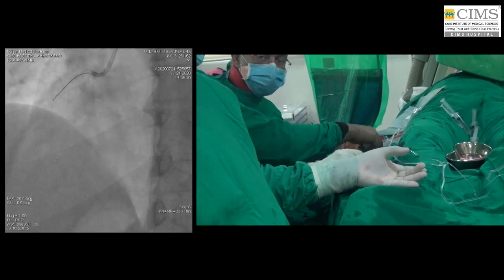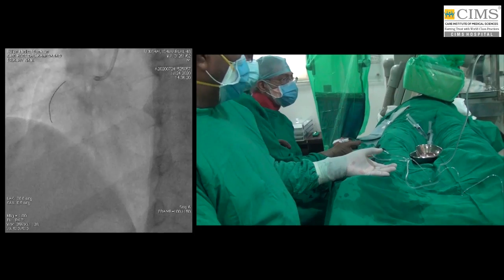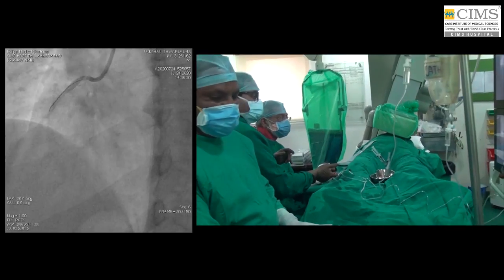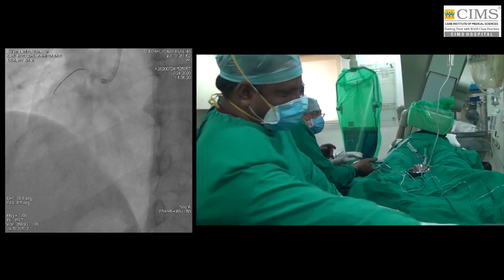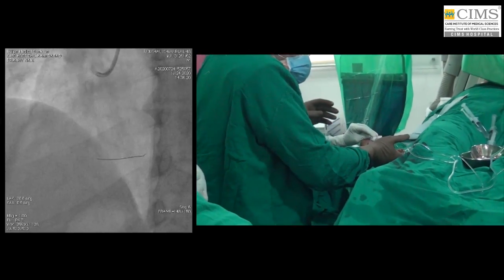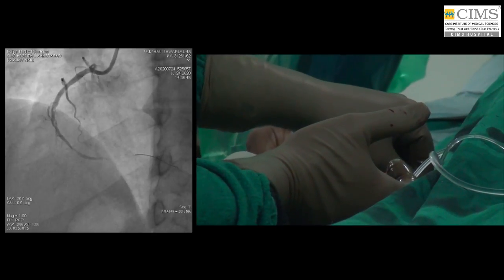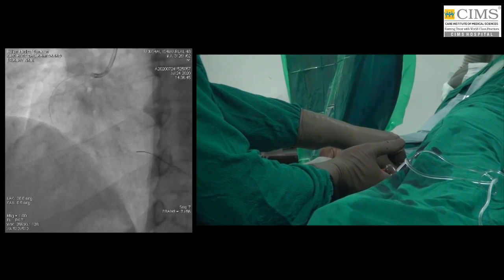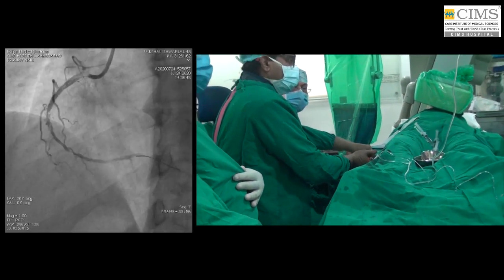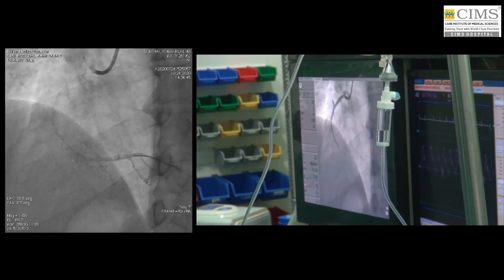Dr. Keyur, one more thing I'm seeing is that you are sitting and performing this procedure. Is this the norm for you? I've not seen many people sitting and doing this procedure. Yeah, I've had long-standing spine issues due to doing angioplasty since 1985. So like an electrophysiologist, I do sit down and take very adequate radiation protection, as you saw earlier, with leg protection, genitalia protection, abdominal protection, face protection, and body protection. So I always do it sitting down.